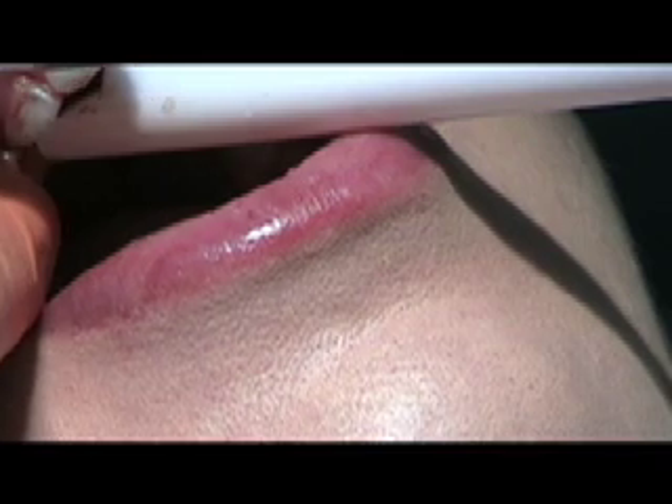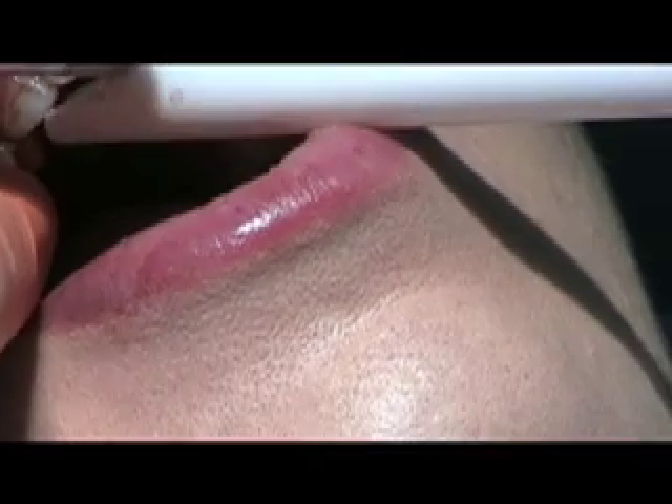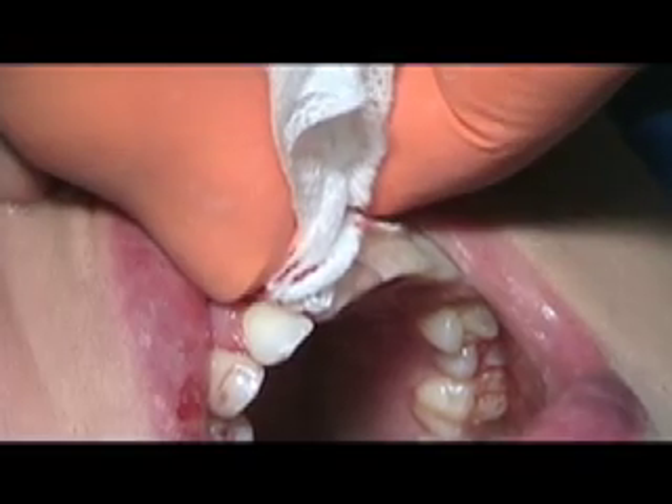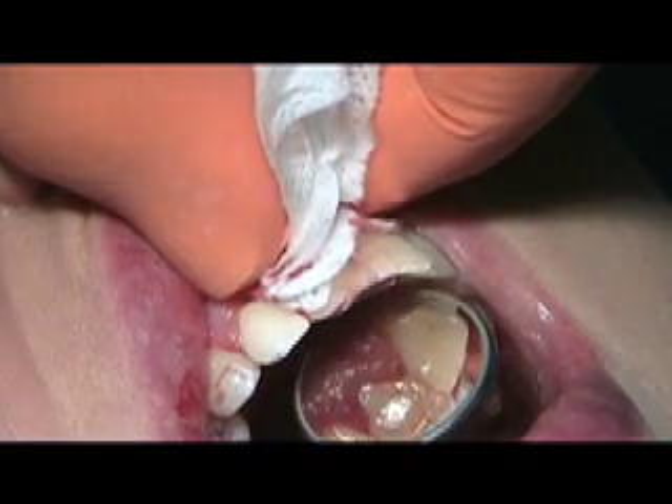Heat, vibration, and pressure are the primary causes of pain associated with the use of the traditional dental drill. Since cutting both hard and soft tissues with the WaterLase does not generate heat, vibration, or pressure, many dental procedures can be performed with fewer shots, less need for anesthesia, less use of the drill, and fewer numb lips.